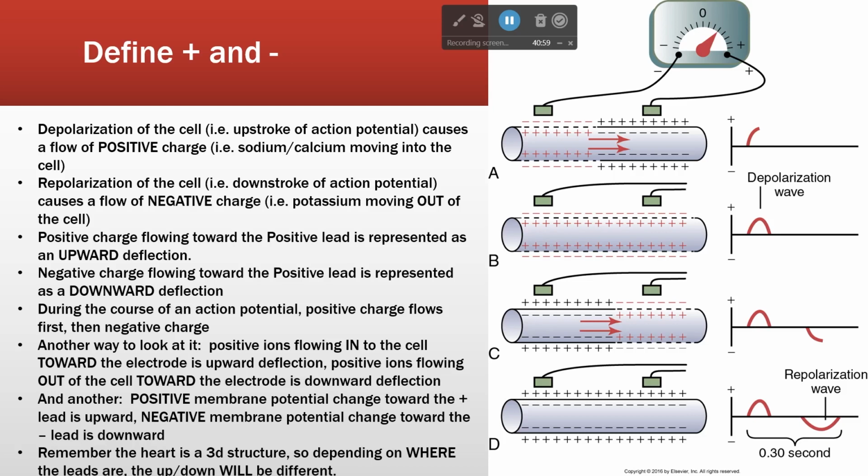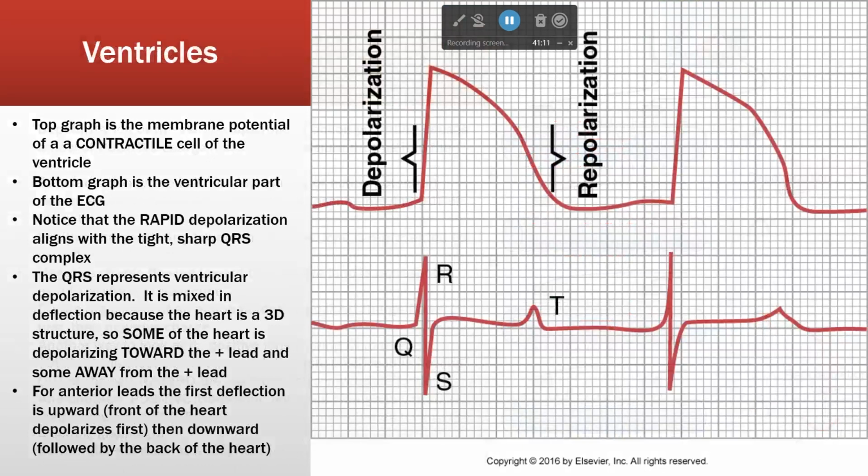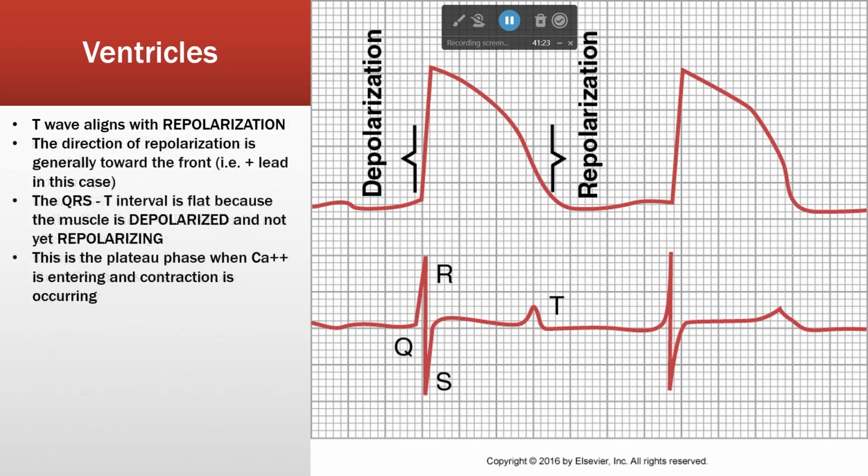So this is ultra simplified. This is basically just how the EKG works. We haven't really attached it to a heart yet, which is kind of the important bit. When we attach it to a heart, what we see empirically is a pattern that looks like this. All right, so we have, where is my P wave?